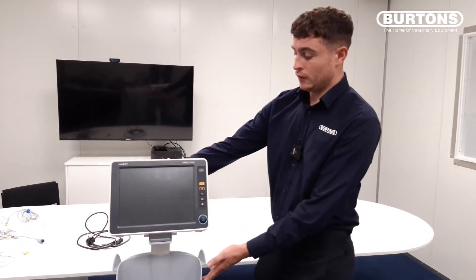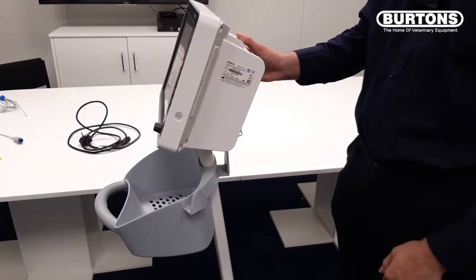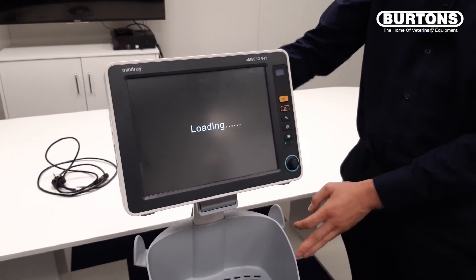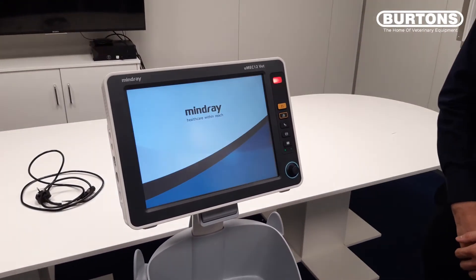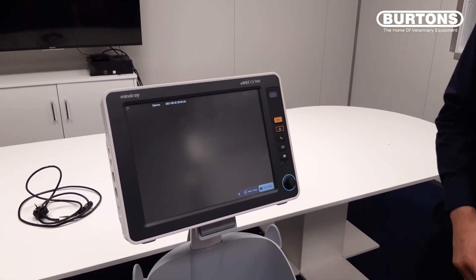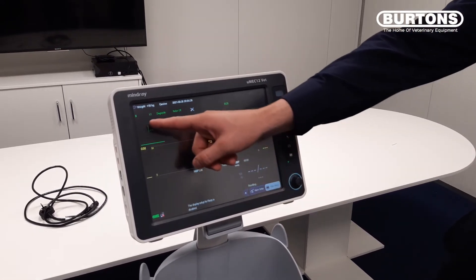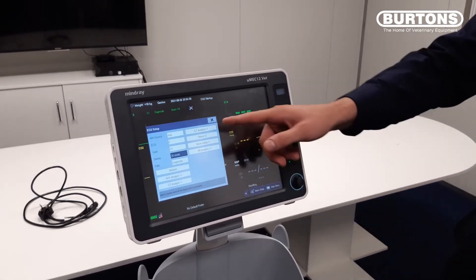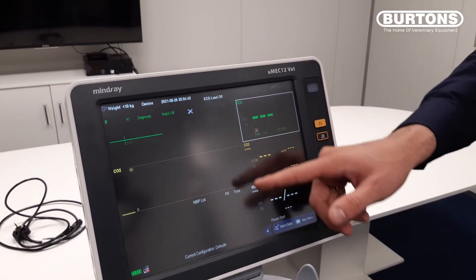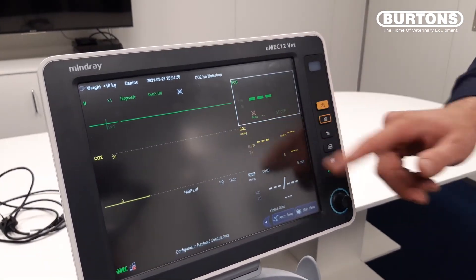To turn the UMEC on, you will see a power button located on the side of the monitor. If we press that, we will let the UMEC boot up. The UMEC is touch screen and we can change anything on the screen simply by tapping on it, and a drop-down box will appear. We can change all the parameters to how we would like it.